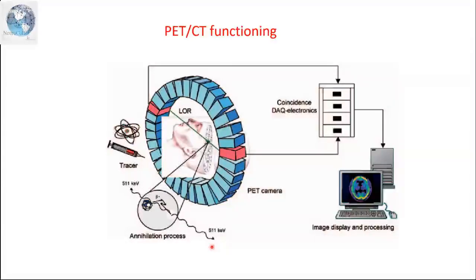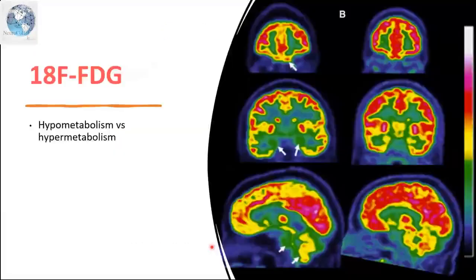Before, it could take like 20 minutes to perform one PET scan, but nowadays with advanced imaging technology, you can do a faster scan. So that's the advantage, from doing just the brain to doing the full body. But today we are focusing on neuroimaging.